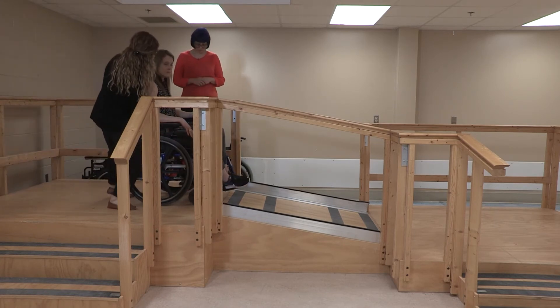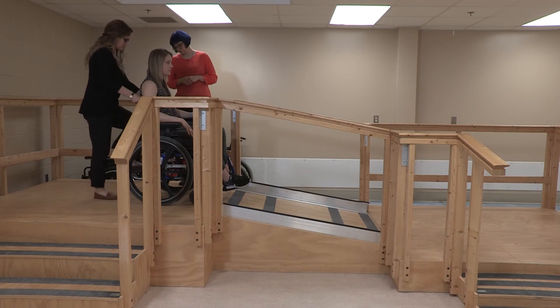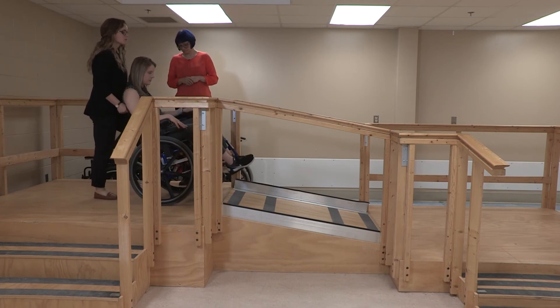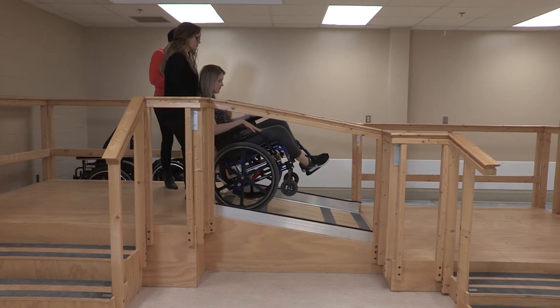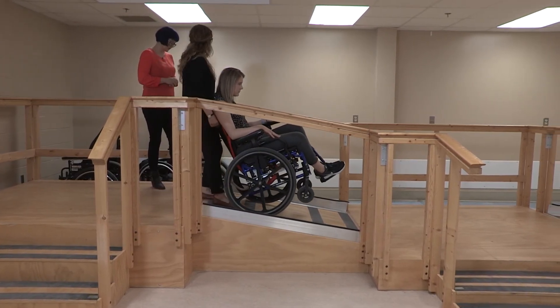You ready? I'm going to tip you back. Okay. Here we go. Okay, there you go.